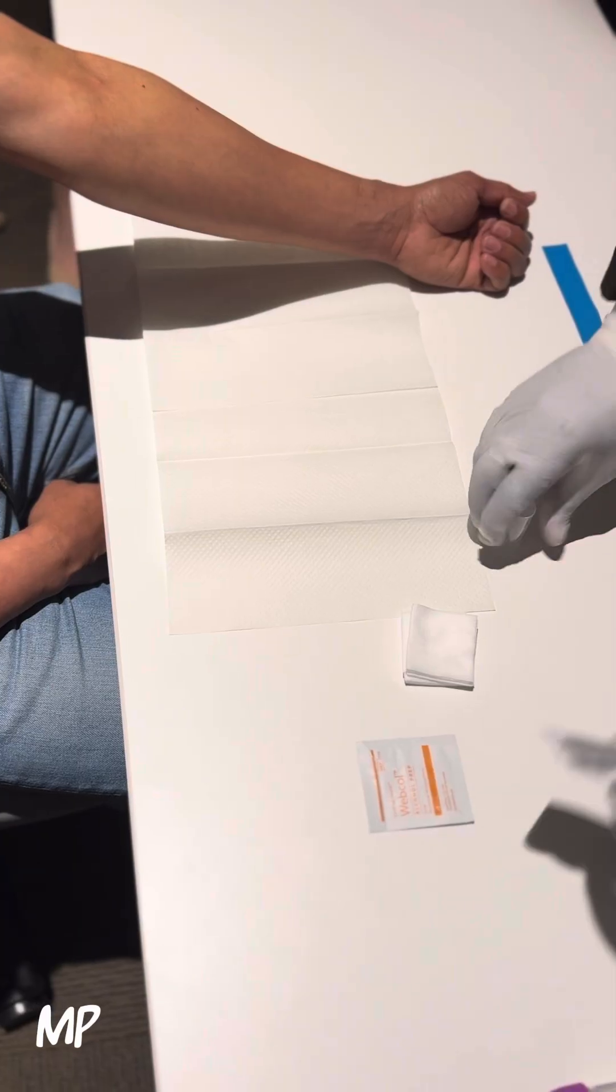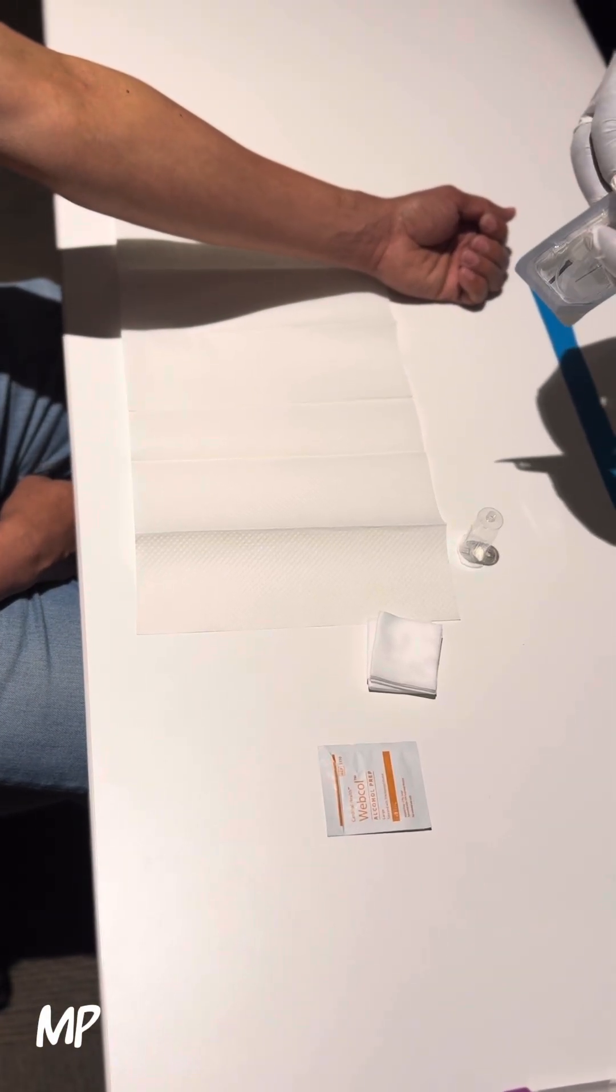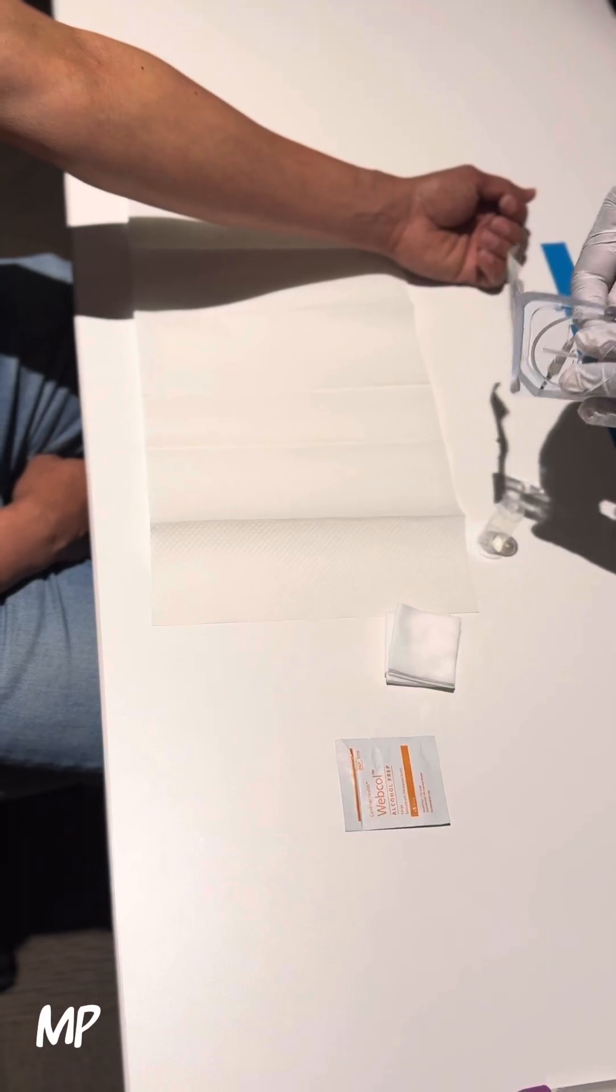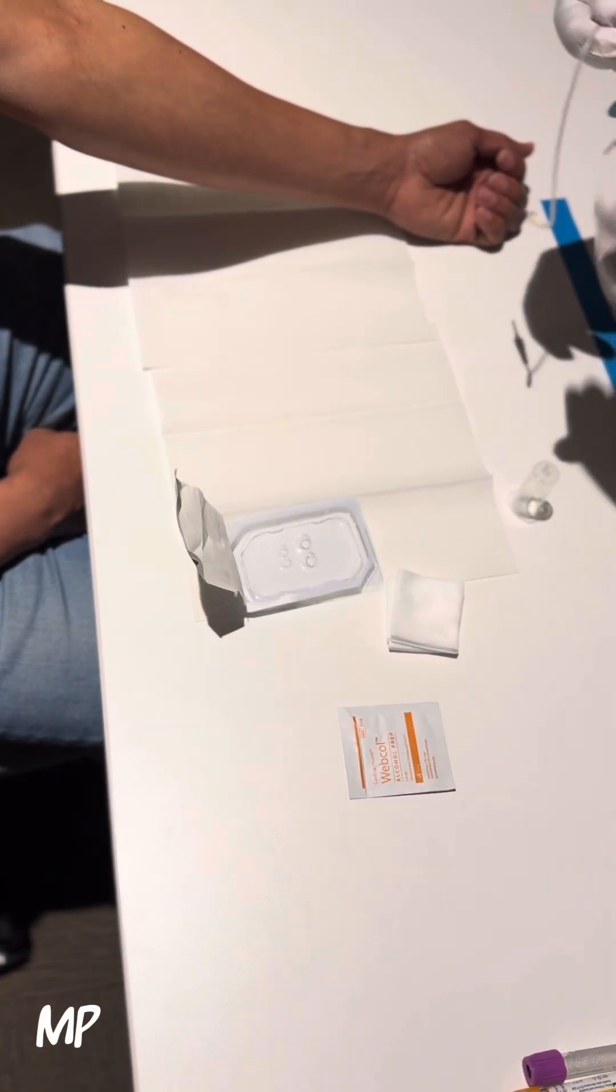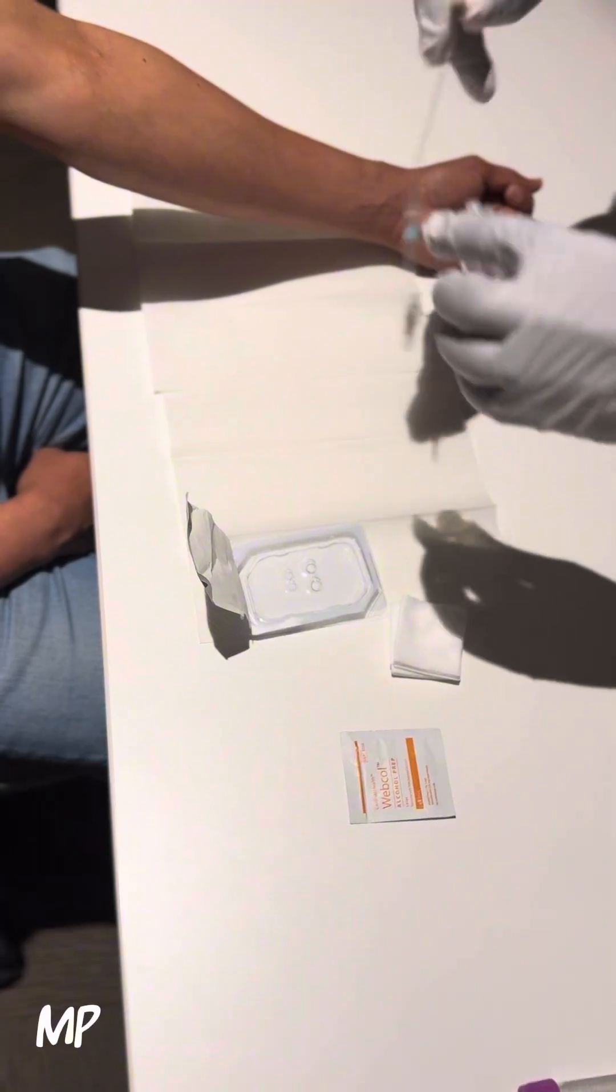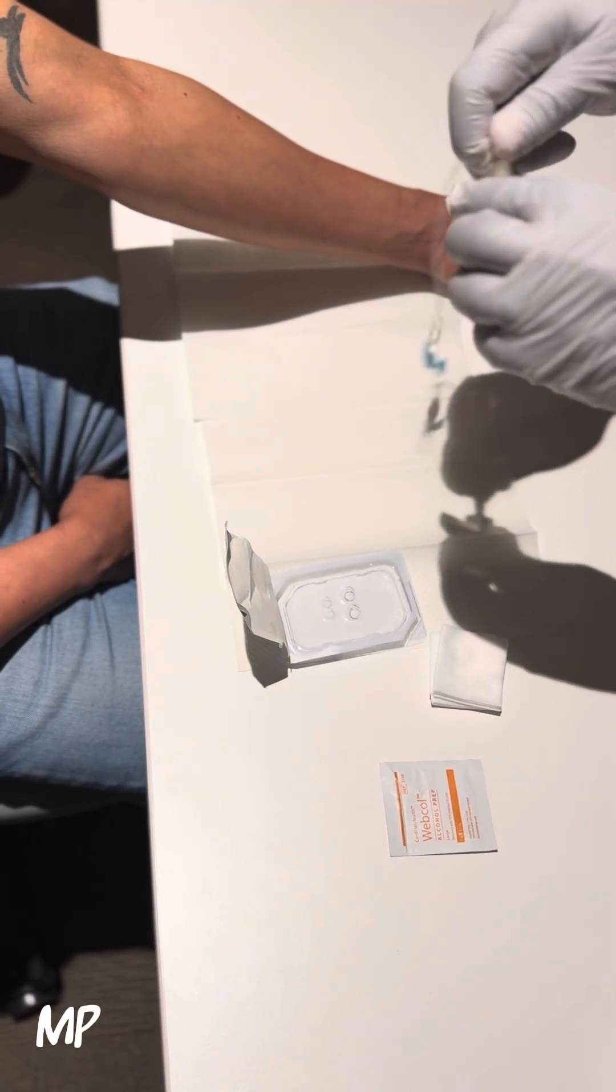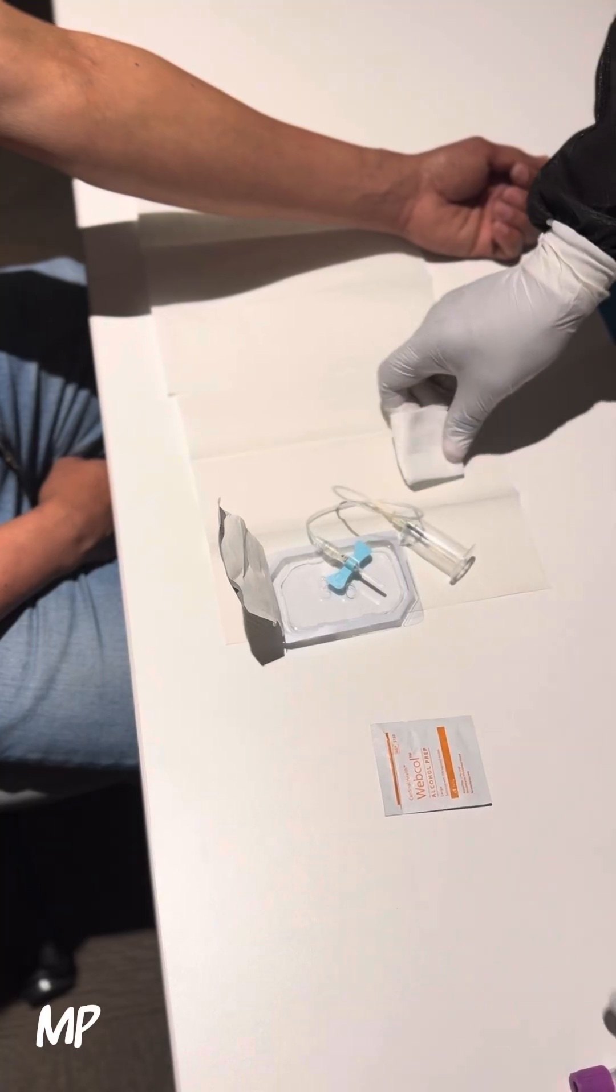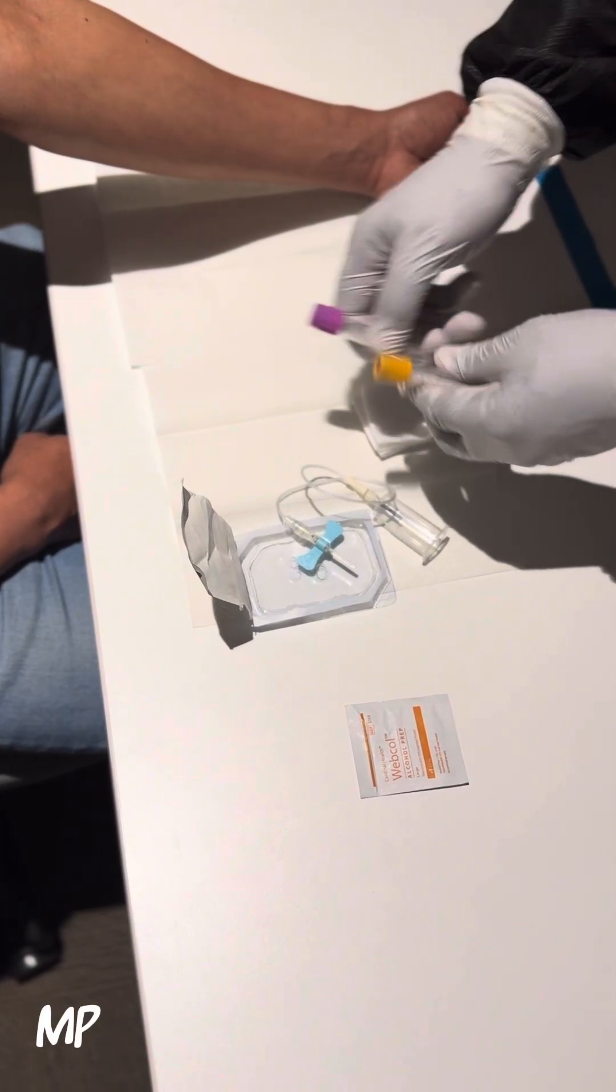While the site is drying, you can assemble your butterfly needle and bring your vacutainer tubes closer to you.